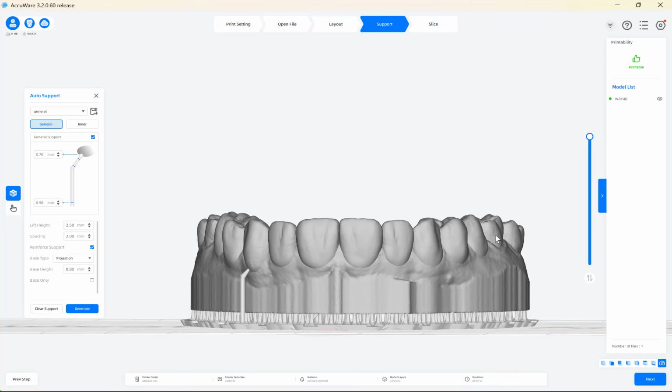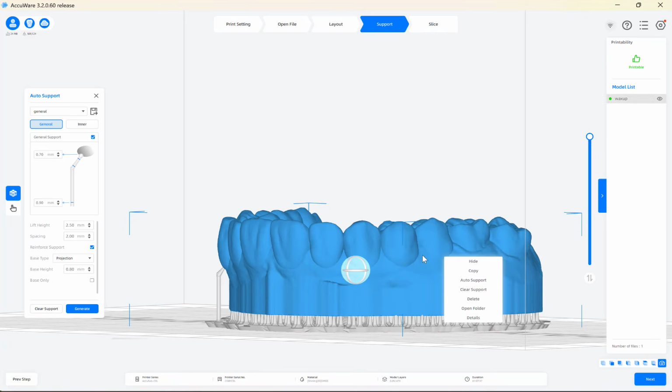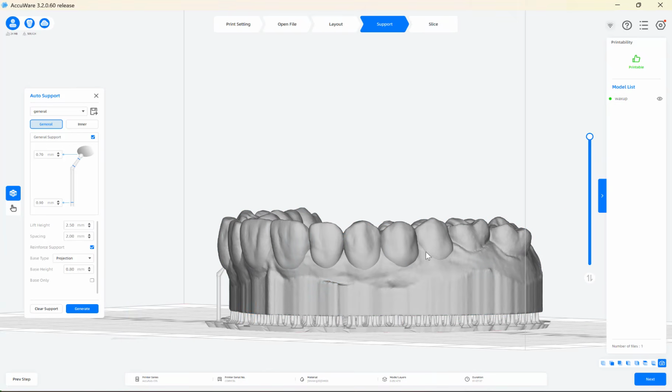All right. I'm going to do that suck down on this. And then once I've popped this off the model, this is where the teeth should end up. And so I'm going to just take either a burr, a hot knife, or a scalpel, and I'm going to trim on the facial exactly to the gingival margin of these proposed crowns, right? This is the wax up. So I would trim exactly to the proposed crown right there.